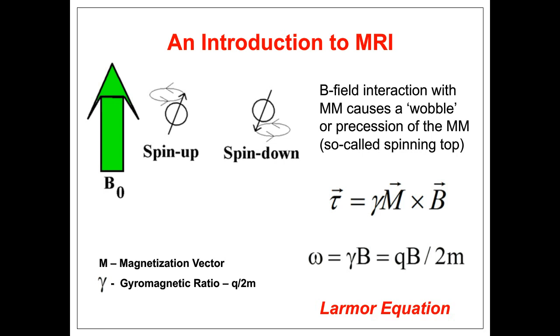And it precesses around that B0 line at a very specific frequency called the Larmor frequency, which is essentially related to that magnetic field strength B and a quantity termed the gyromagnetic ratio. So notice before I said if you want to increase the net magnetization vector, which will eventually increase the signal that we're receiving, you're also increasing the frequency of that precessing net magnetization vector.